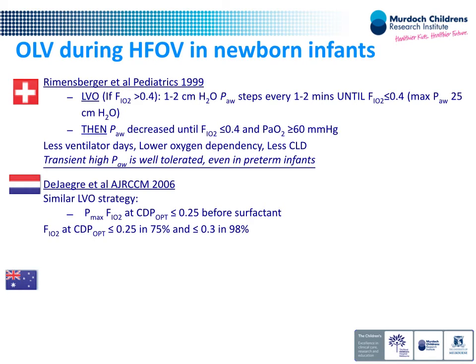And they found that using such an approach, and you can correct me if I'm wrong here, 75% of babies could be brought down to 25% or less pre-surfactant, and almost 100% could be brought down to less than 30% in first intention high frequency. But some of your babies weren't day one of life. You had some that were 72 hours or so of life because you're a referral centre as well. But again, with a proven atelectatic lung disease.